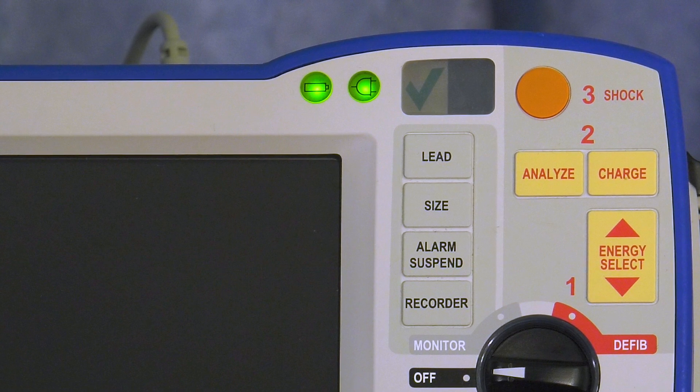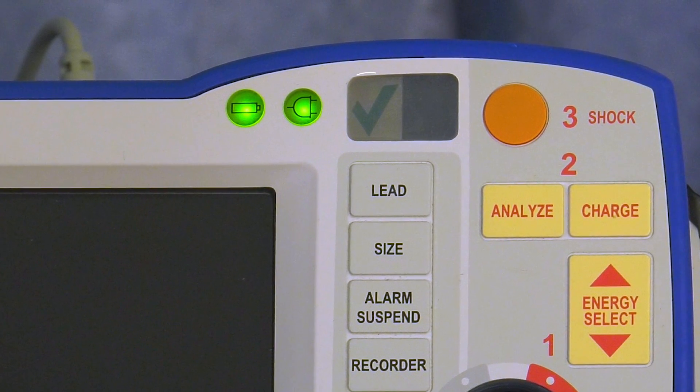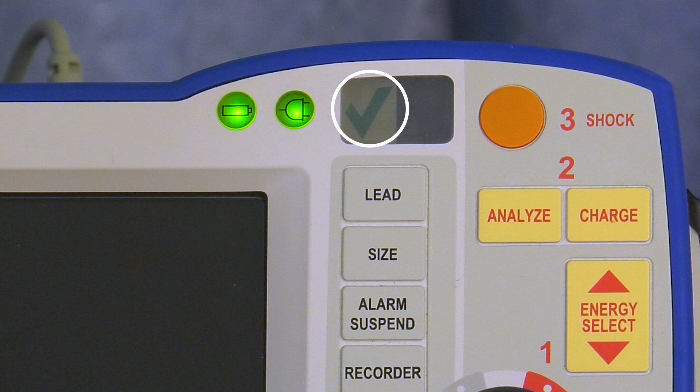Before using, verify that the R series defibrillator is ready for use by noting the green checkmark on the front panel. If a red X is present, one person should attempt to deliver therapy while another runs to get a defibrillator with a green checkmark.